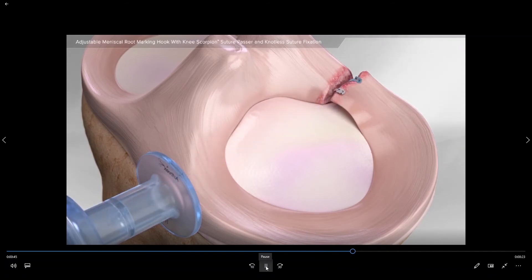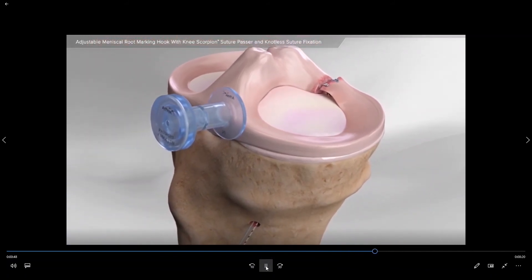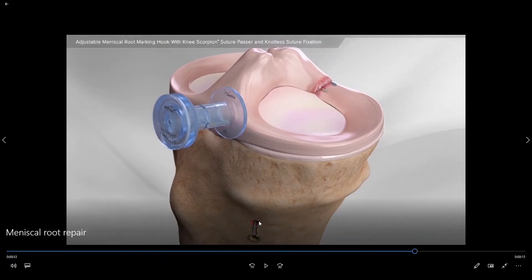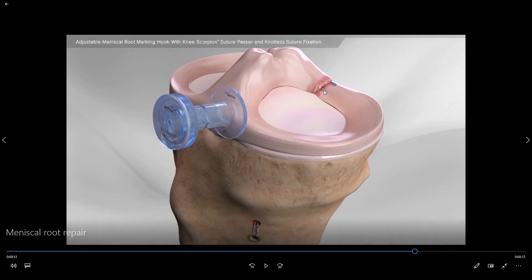This allows us to attach the sutures down in the front of the bone with a screw. As the sutures are pulled down and placed into the screw, they are essentially suturing the meniscus root back down to the floor of the joint in the back.